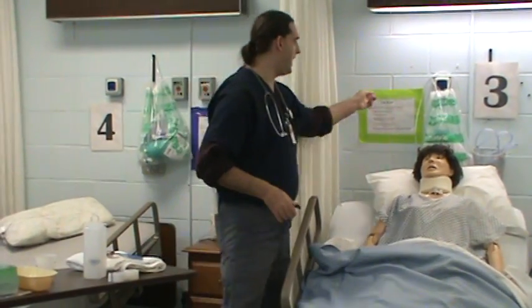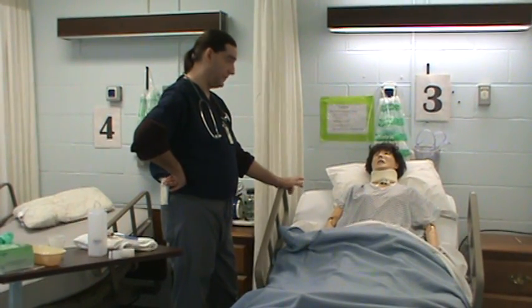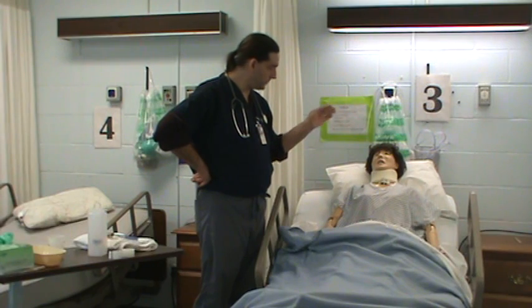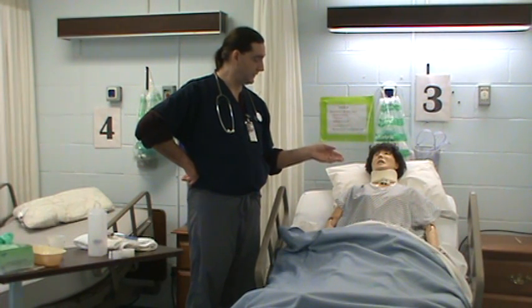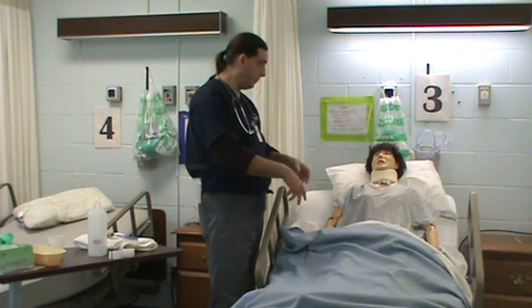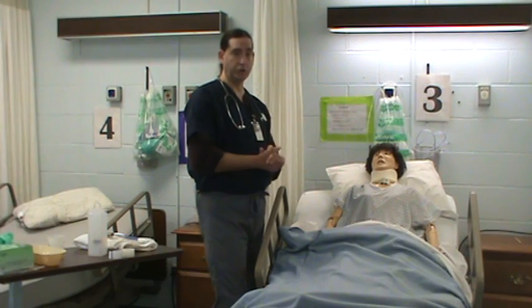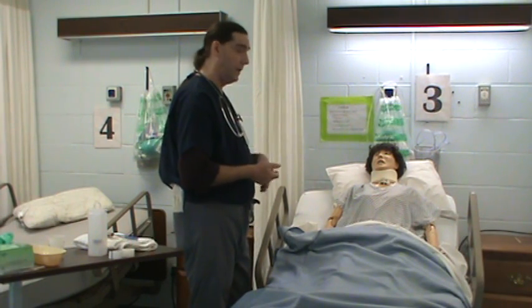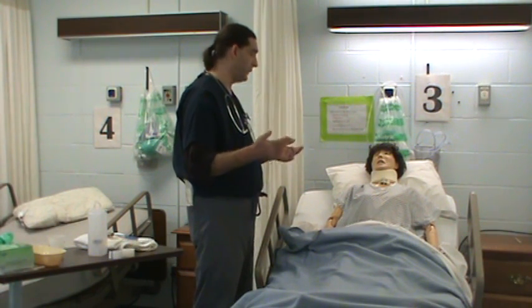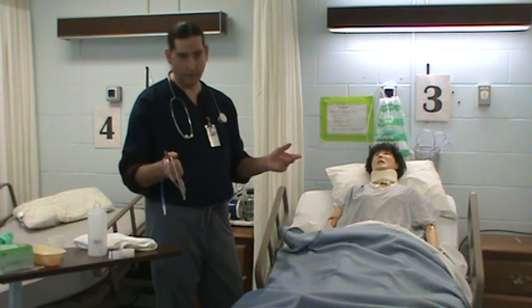Then I'm going to provide adequate lighting and tell my patient: 'I'm Jim Adams, I'm your nurse, I'm here to place an NG tube down your nose per the doctor's order.' Sometimes they'll ask what that is. I'll explain: it's a tube that goes from your nose, down the back of your throat, through your esophagus, and down into your stomach. Then I'll tell them why the doctor ordered it — to pull everything out of your stomach because nothing's moving through, for a GI bleed to suction blood out, or for medications and bolus feedings if they can't swallow.